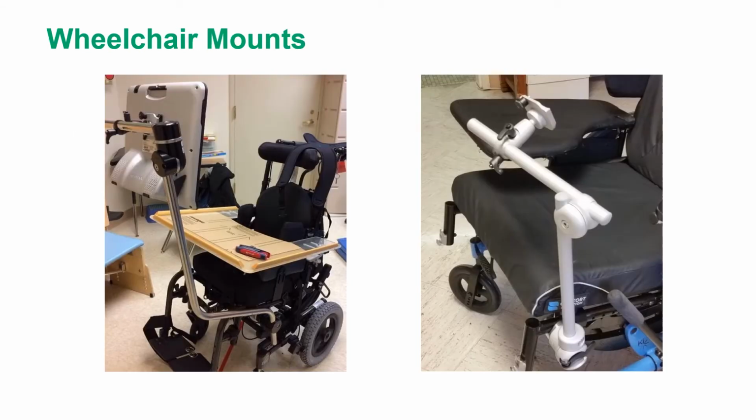Finally, we have wheelchair mounts. A wheelchair mount attaches directly to a wheelchair, both manual and electric wheelchairs. There are different types of wheelchair mounts that fit each individual's needs, the type of AAC device, and the different types of wheelchairs. A wheelchair mount is typically the primary mount for a wheelchair user and may be used whenever the user is in the wheelchair.